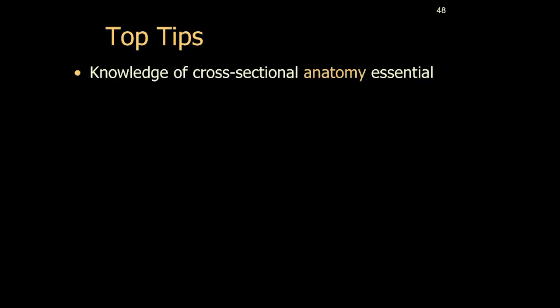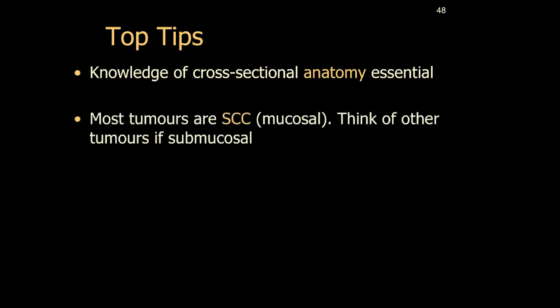So to summarize, here are my top tips. Firstly, a knowledge of cross-sectional anatomy is absolutely essential. If you know the anatomy, the battle is already half won. Most tumors are squamous cell cancers. Think of other pathologies if the clinician tells you that this is a submucosal lesion.